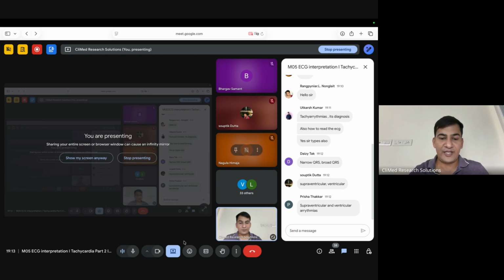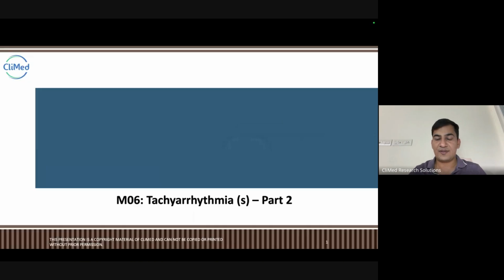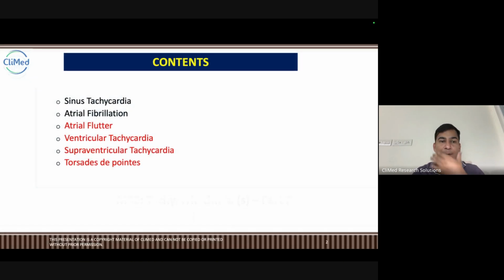Okay. So, anyways, let's start. Let's start the class. Today we are talking about two tachycardias, sinus tachycardia and atrial fibrillation, because this is very tough to discuss everything in one, right?